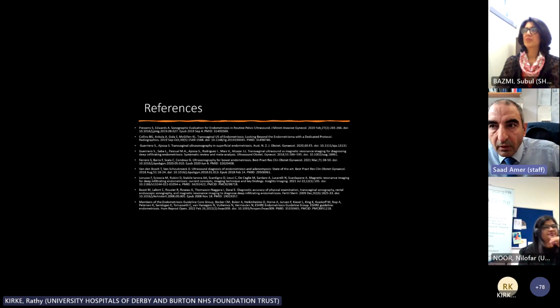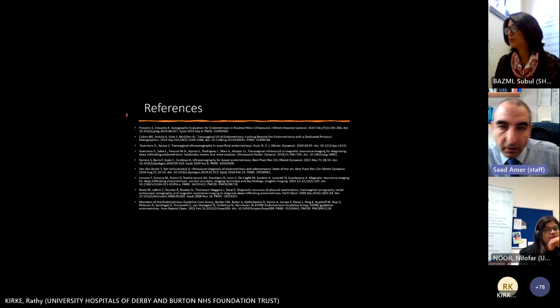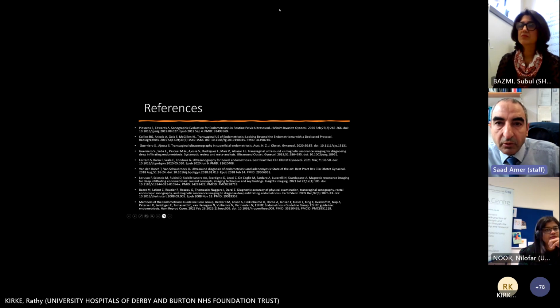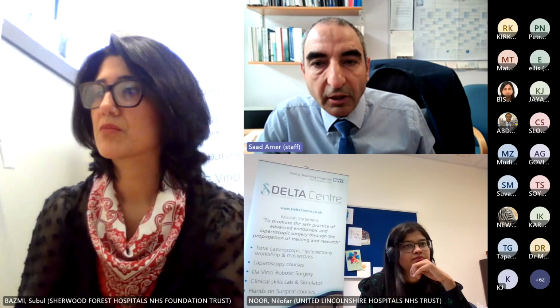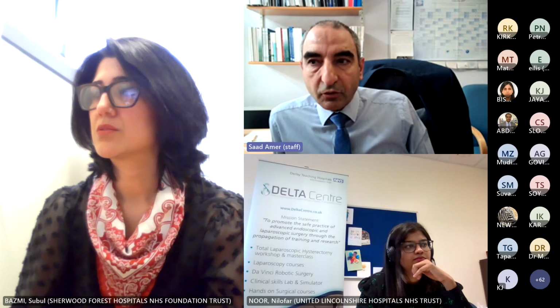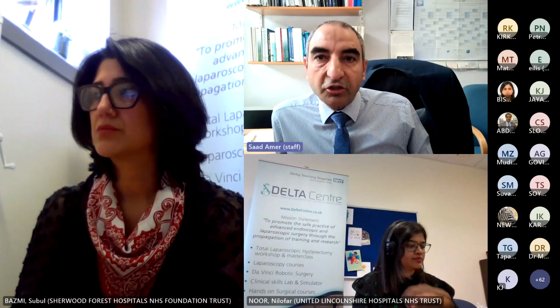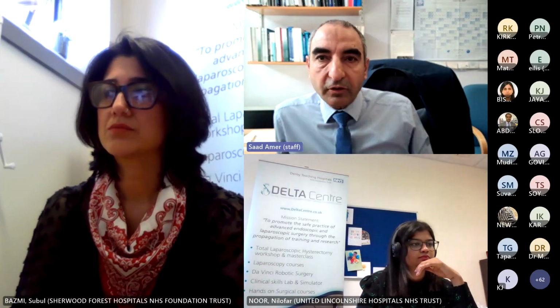Thank you very much, Rathy. Really excellent talk, and your input into the MDT and the Endometriosis Center has been really, really valuable. As surgeons, we now review the MRI with Rathy and then take the patient to theater, and I think it's now near perfect correlation, whatever the depth of invasion, with what we see. And the nice thing is we share this with Rathy and she can show us the images, and we go at laparoscopy. When you put the scope in, you can't see it, but when you start to dissect, it's there.